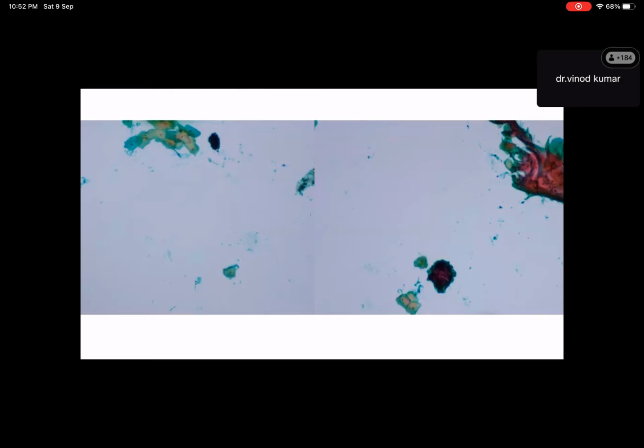Now, Sajana, I told you that she had her LMP 7 days ago, isn't it? That was part of the history. So what do you think these clusters are? Ma'am, these are the exodus ball. That is the endometrial cells. Yes, very good. So these are the endometrial clusters.